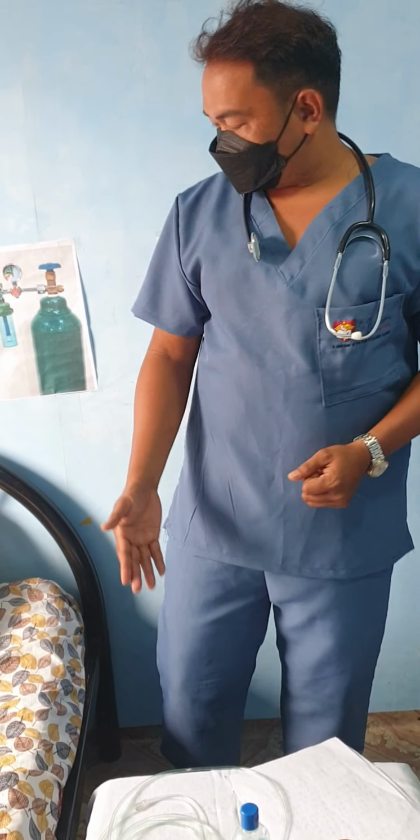The purpose of oxygen administration is to supply or increase the supply of oxygen to the body, to soothe the irritated mucous membrane, to loosen mucus and secretions in the respiratory tract, to provide high humidity to liquefy bronchial secretions, to serve as a respiratory stimulant, to facilitate normal metabolism of the tissue, and to reduce and correct an arterial hypoxemia, or low concentration of oxygen in the blood or tissue, hypoxemia or hypoxia, to decrease the work of breathing.